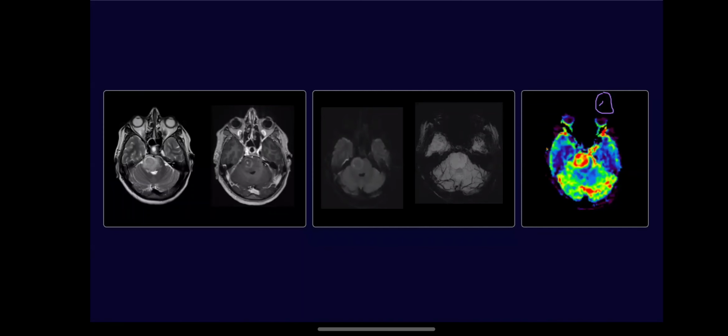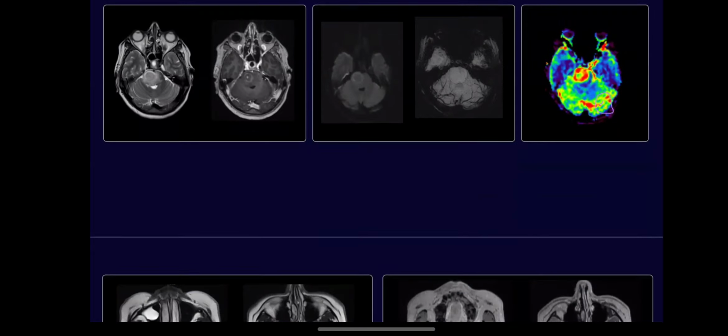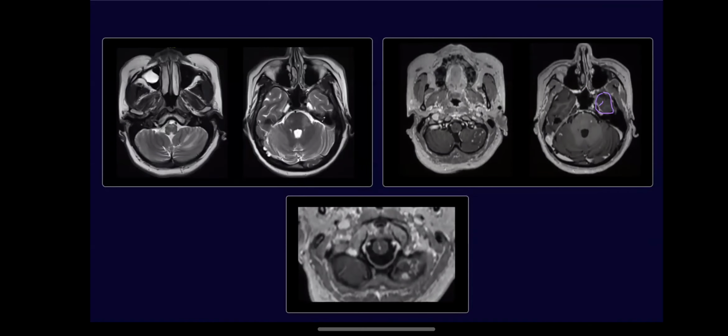But in the follow-up imaging, we performed perfusion, because we thought that an insidious history with such a large lesion sitting in the brainstem is not in keeping with an infection, right? So we were smarter. At the follow-up, of course, we got the perfusion, and we saw this massively raised perfusion, and we sent the patient up to the neurosurgeon. So this turned out to be a case of glioma. And I will say that, particularly in the context of giant tuberculomas, it's not very uncommon that you have a presentation very, very similar to gliomas.